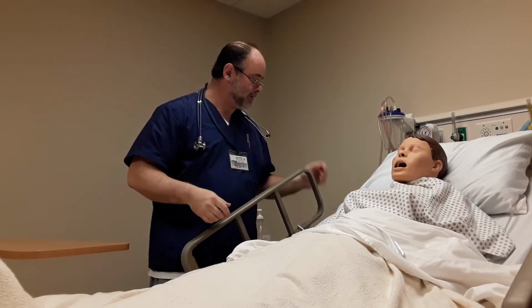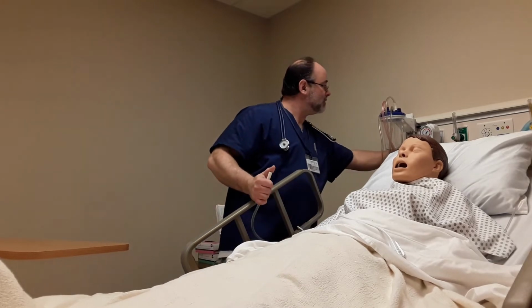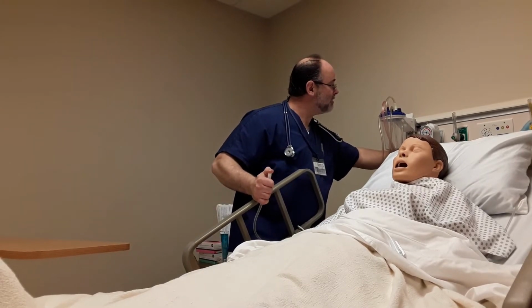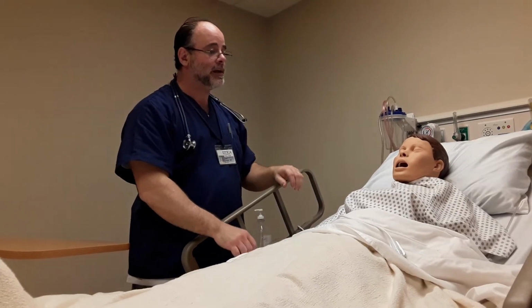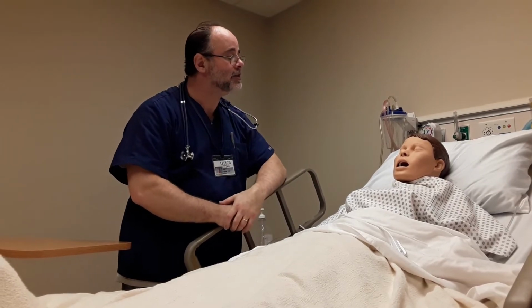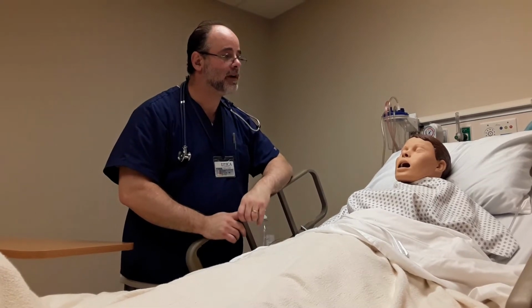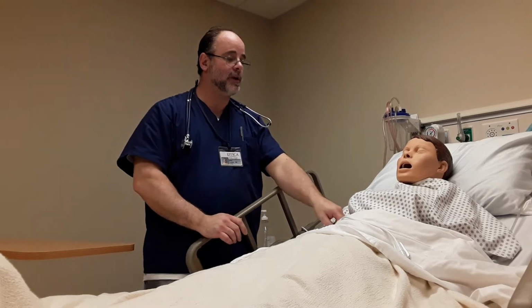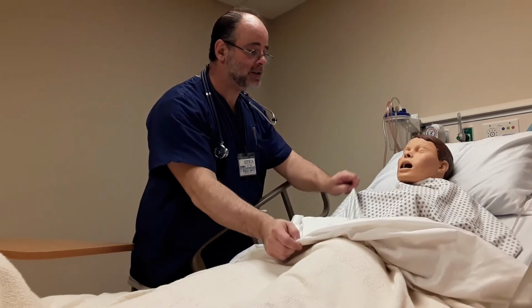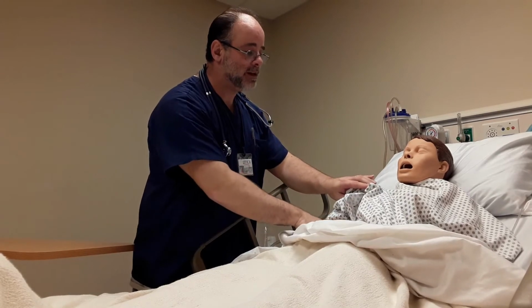Again, with the procedure, I'll check a few things out. As far as the suctioning is concerned, I don't have a suction order yet per se. We have to place the tube and make sure it's in place and things of that nature. But I brought the patient's bed up to a comfortable position. Assessments done for this patient before we actually do the procedure are to listen to lung sounds and bowel sounds and to palpate the abdomen to make sure that there's nothing going on.